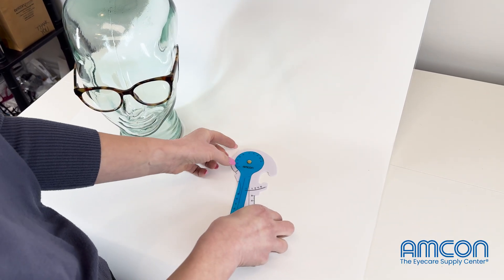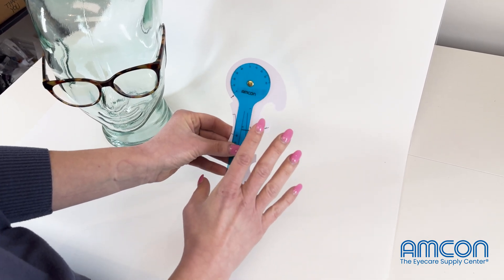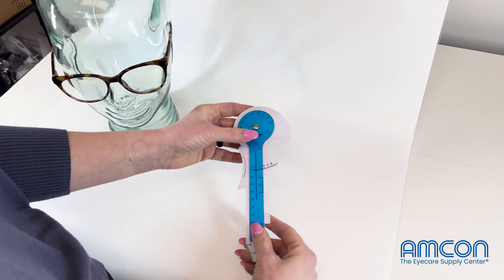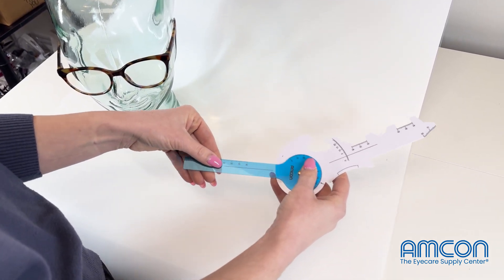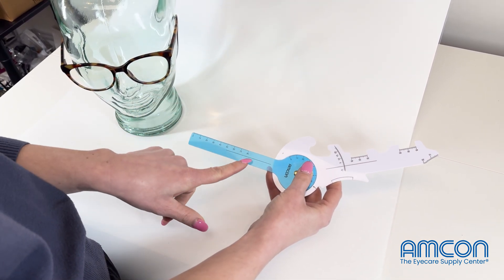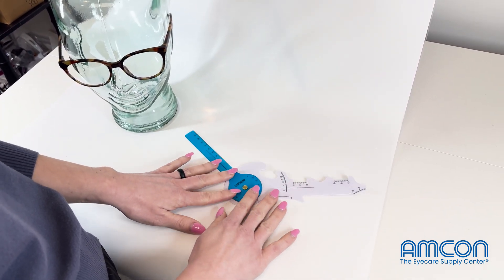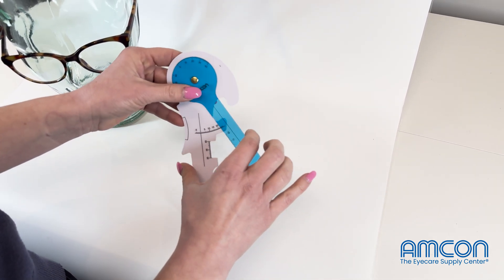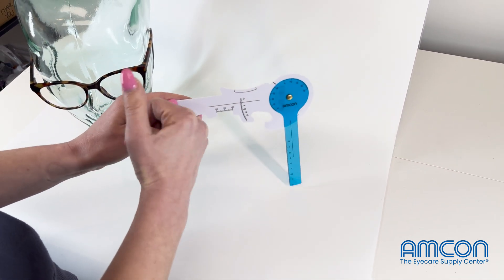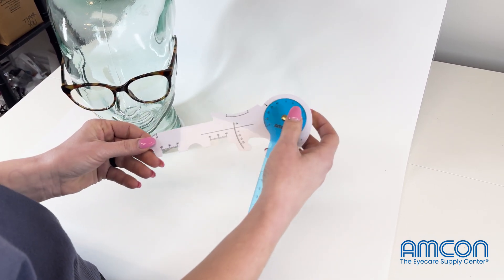Here we have Amcon's newest measuring device — a multi-use ruler. This ruler measures your standard PD, going up to 80, and it also measures face form, vertex distance, pantoscopic tilt, and it has a loop to measure pupillary distance as well.